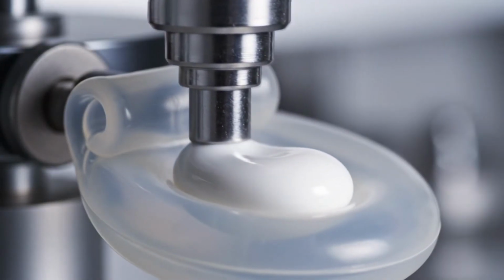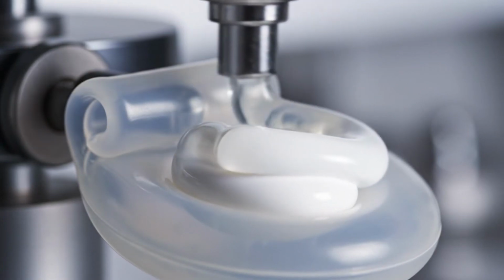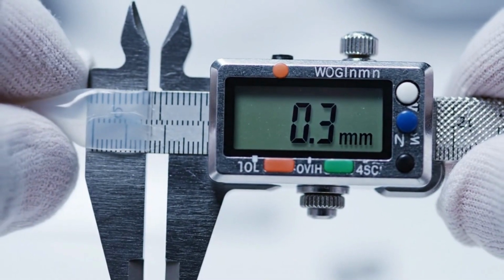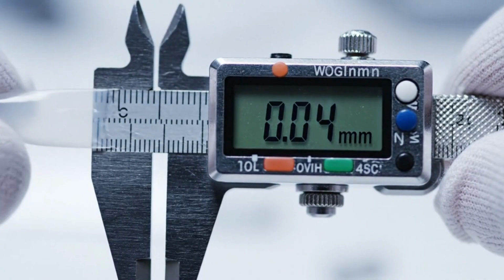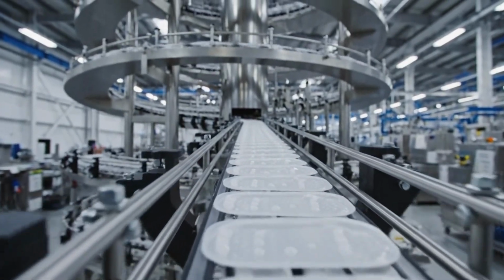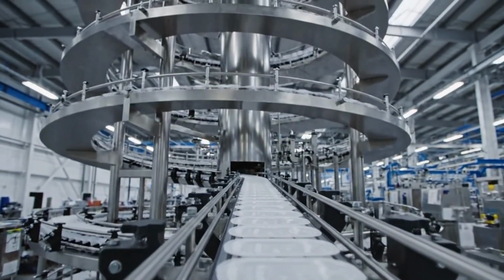For specialized performance, we add active ingredients that are medically approved for endurance and control. The challenge is to make the rubber as thin as a human hair while maintaining its legendary strength. Controlled cooling locks the 3D features into the rubber, ensuring they remain prominent even after being packed.